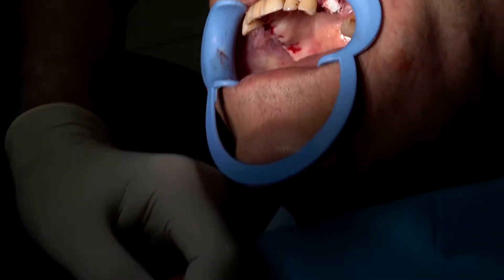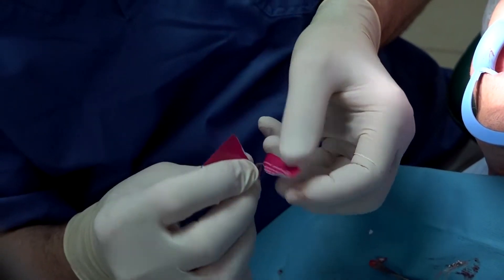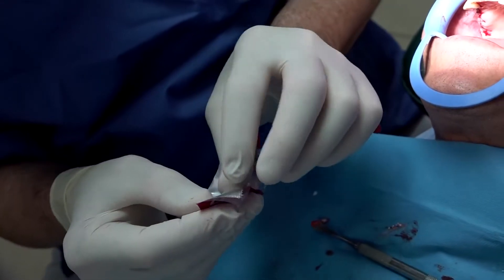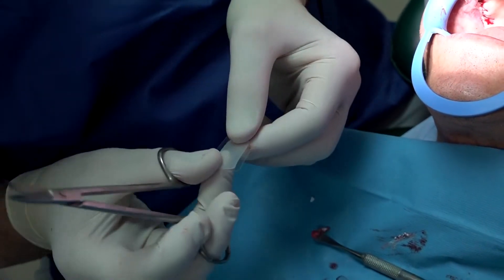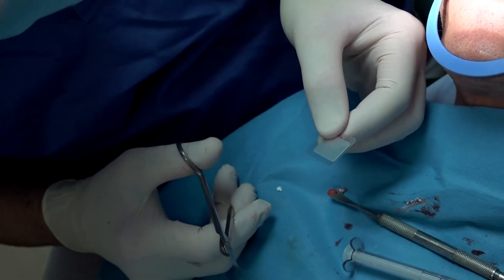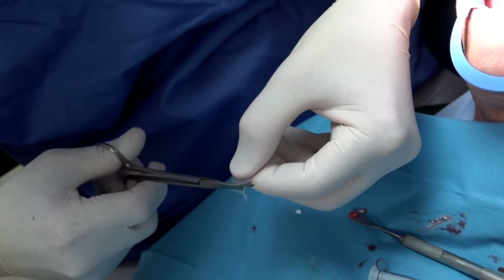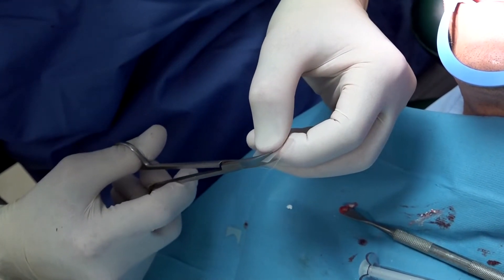This is the AuraAid — that's how it looks like. Now we trim it to the size that we will need, because it needs to protect the area so that the graft will not be physically exposed. Otherwise, the graft can wash out.